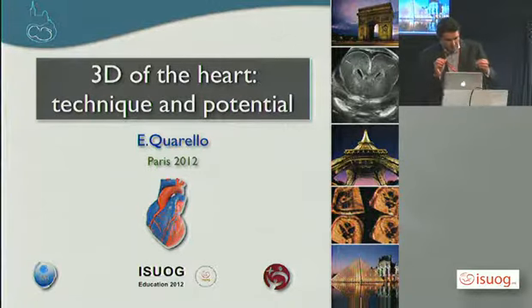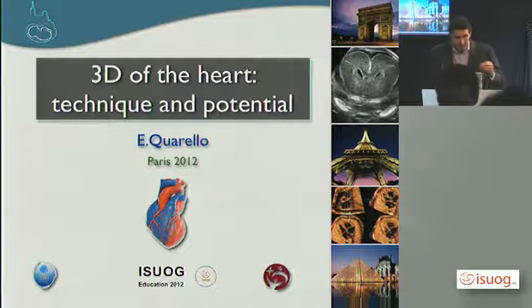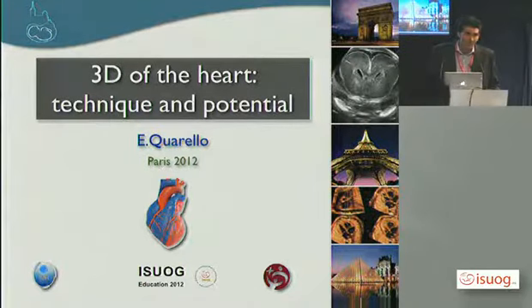Good evening, everybody. The purpose of my talk is to speak about 3D and 4D of the fetal heart, technique and potential. I just have to say that 3-dimensional and 4-dimensional ultrasound have been proposed for several years, nearly 20 years now, as being considered valuable tools in obstetric imaging.